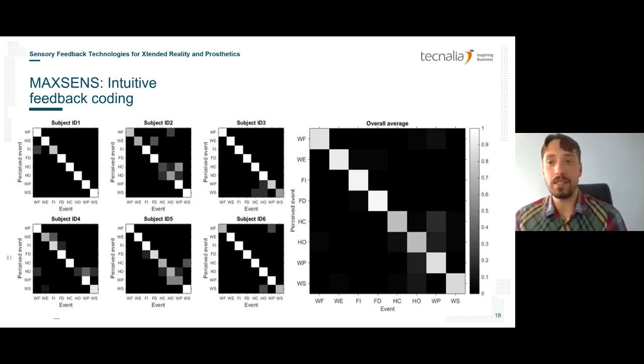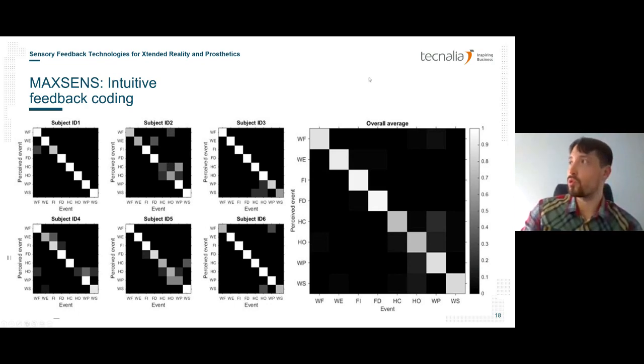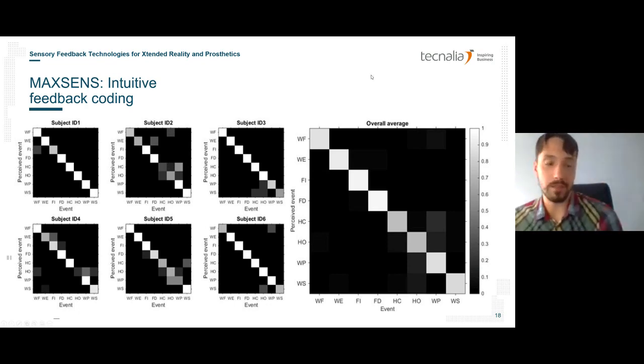That was one thing. The other thing that we knew is that they can use it in prosthesis control to improve the force that is being applied by the prosthesis. And we knew that they can actually improve over time. So these three conclusions from what we did in the prosthesis application led us to believe that this can be very, very useful for other applications. And like this, we came to the idea to use the same modality for something completely different.